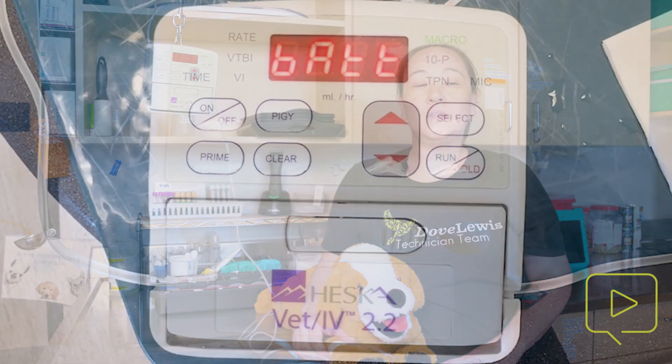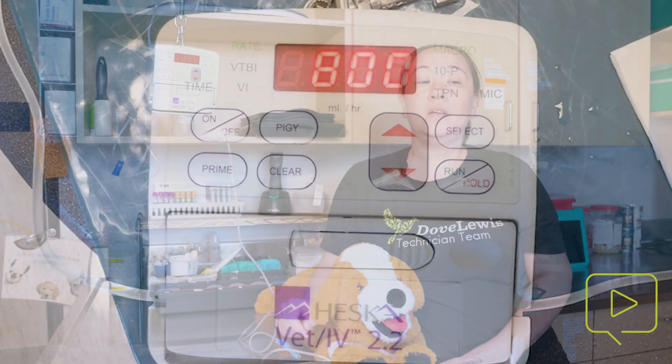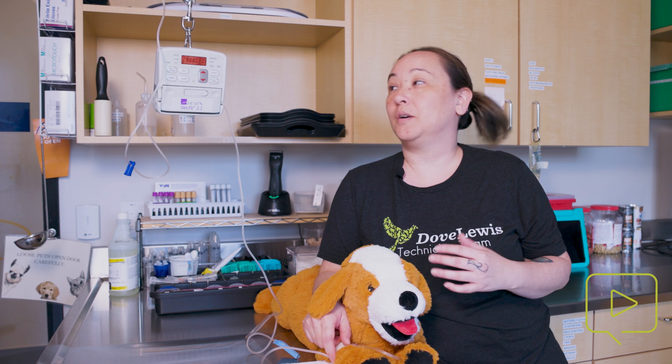This alarm is the low battery alarm. What this indicates is that your Heska pump needs to be plugged in. There is a spot for the plug to go in — plug it into a power source. The low battery alarm is telling you that you have approximately 15 minutes left before your Heska pump is going to completely shut down.